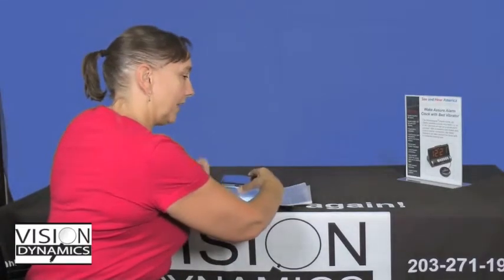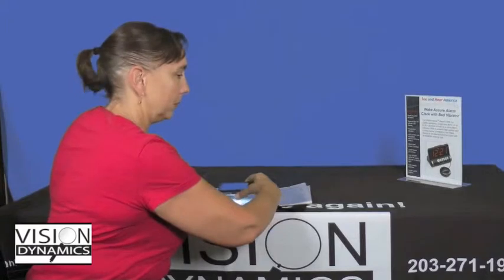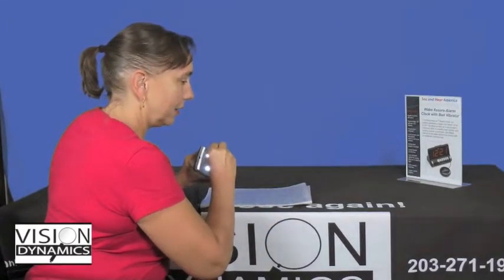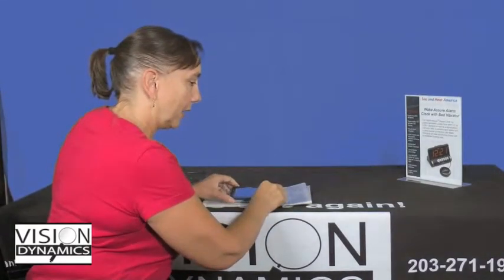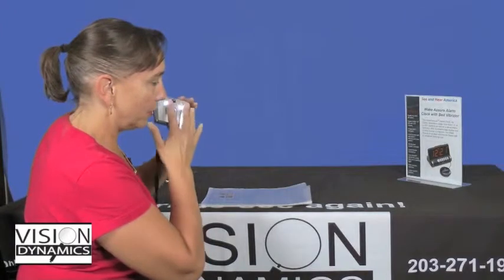Otherwise, you've got to maintain the distance yourself, just freehand, and that can be a little more tricky from time to time. So having that stand swing out makes it so that you can just glide it along at your convenience. That's found right in the back, on the top back end of your Mini.